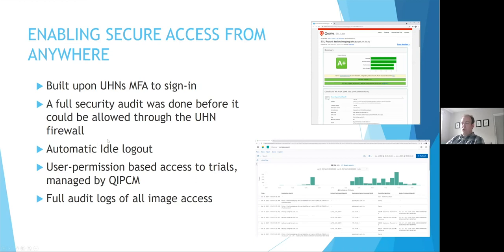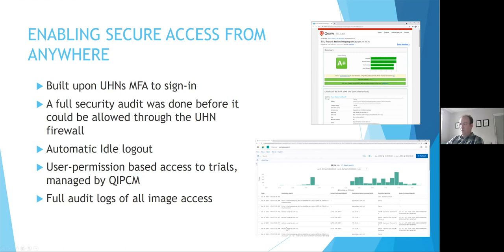For clinical trial-based security, we also needed to add a few different protocols. One of those is automatic idle logout — if the user has been logged in for too long, it logs them back out. We also have user permissions based on access to their trials, meaning if someone logs into the system they can only see their own trial's images and not all trial images, though we can still add multiple trials to a user. Finally, we have full audit logging of everything, which is very important from an REB and security permissions standpoint — we can see exactly who accessed what images on what date and time.